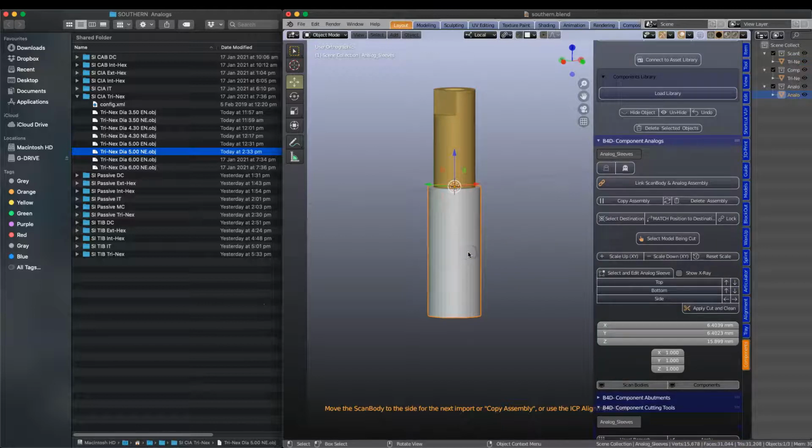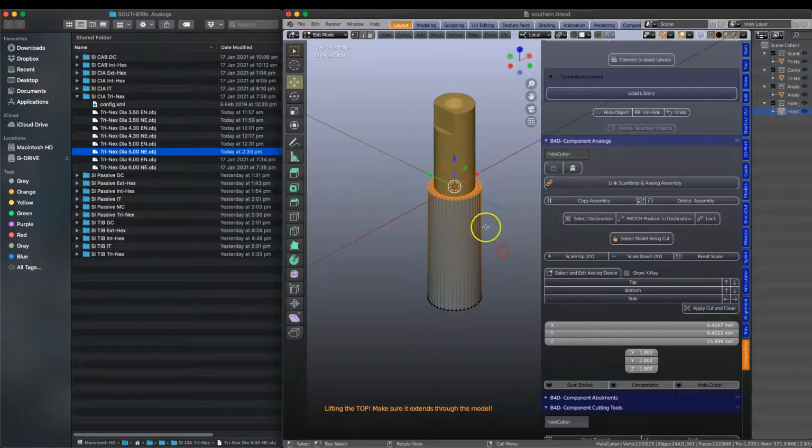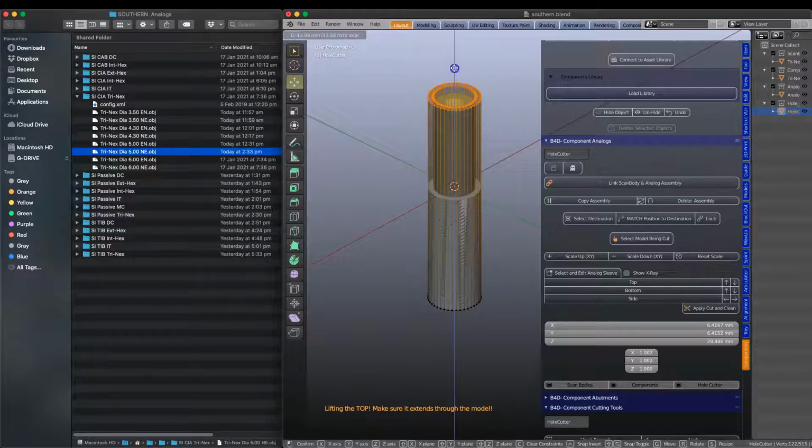Alright, so we're going to select the actual, now while we don't have a model here, we don't need to select a model and so on. Select model, we don't need to do this now for testing sake. We're going to just select the analog sleeve because it is called analog sleeve. The coding should pick it up. We're going to push select here. Select. Then we're going to select the top. The top vertices should be selected, so we can pull it up like that.